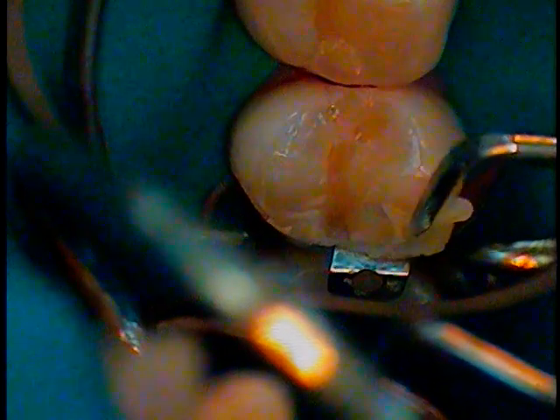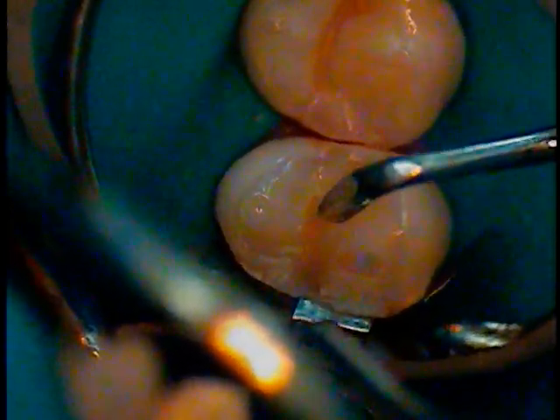Okay, overbuild it a little bit. Come over the margins a hair. Wipe. Okay, so that's in there now. I'm going to cure that. That's my buccal wall, buccal incline, and central groove. And I'm going to come across and do the lingual, and then we're done.